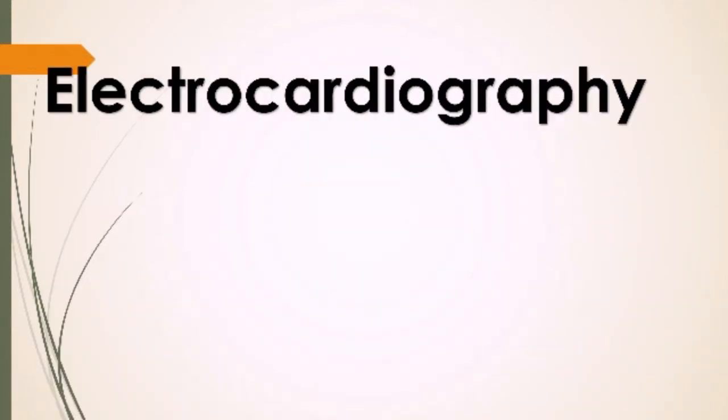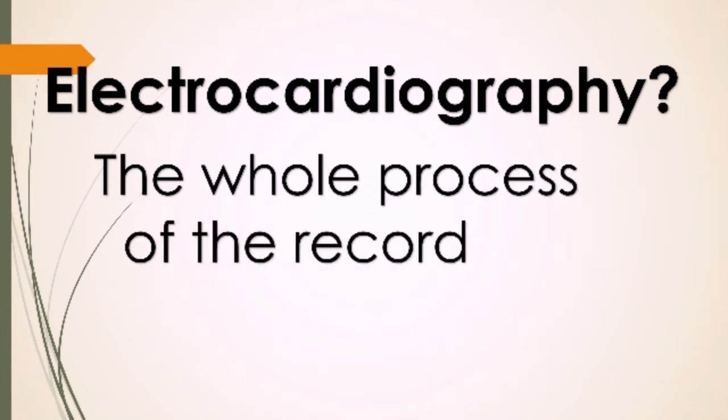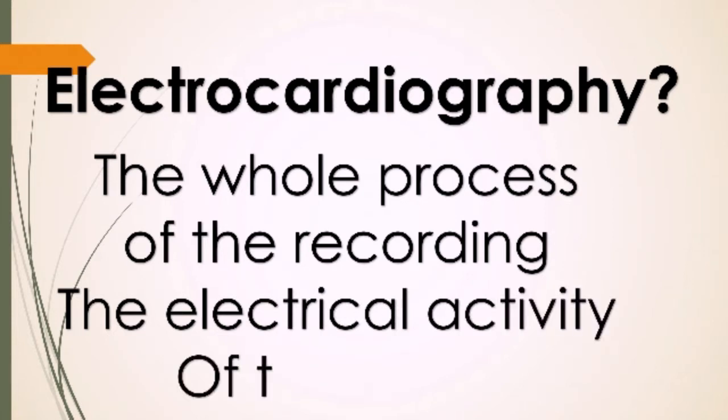Good. The third term is electrocardiography. You wonder, what is electrocardiography? You remember the first one was electrocardiograph, the second was electrocardiogram, and this third one is electrocardiography. This is the whole process of recording the electrical activity of the heart. The whole process, taking the machine, using it to record the ECG, that is electrocardiography.